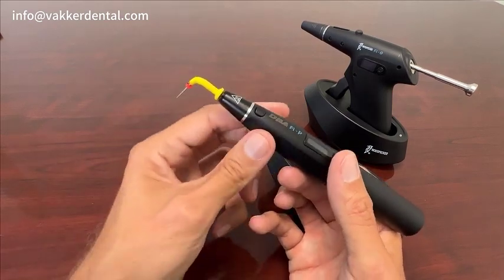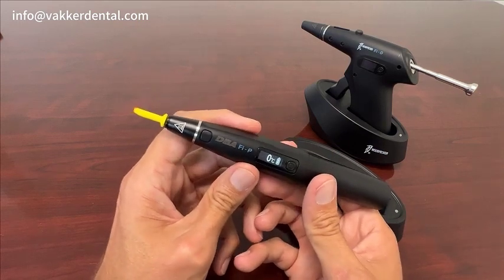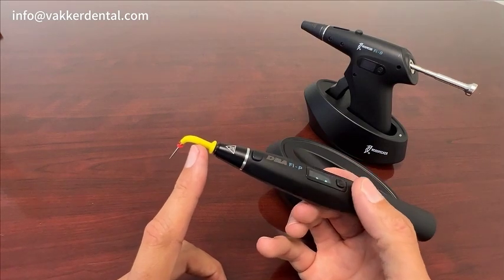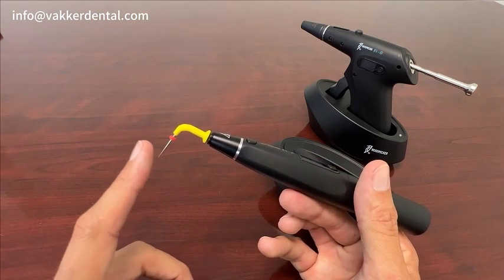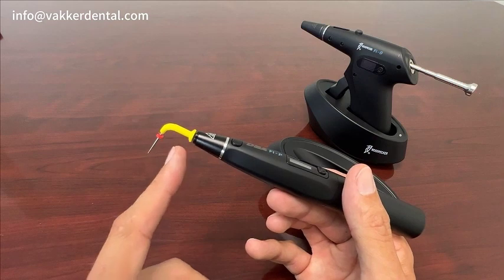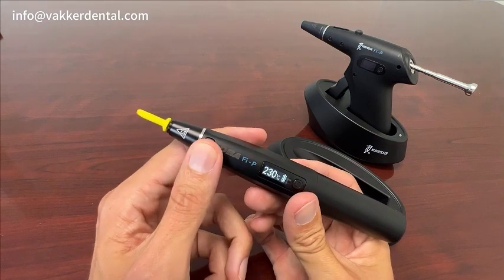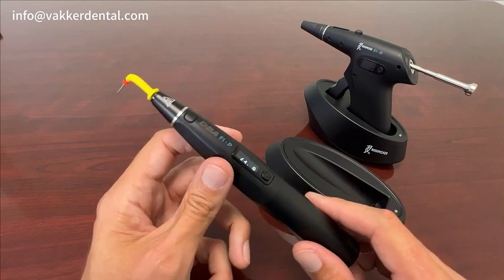These tips are autoclavable and they do last a very long time. One thing we hear is people calling in saying their pen isn't working — there's actually a heating element inside the tip, and when that heating element goes bad, the tip won't work and they think it's the pen. But really it's just time to replace the tip. They can be somewhat fragile, so you don't want to drop them. They are autoclavable and we do sell them — they come as a single pack. Just adjust the heat, press the button, and it's already at operating temperature. Very simple to use and very fast, and we've had a lot of great feedback.